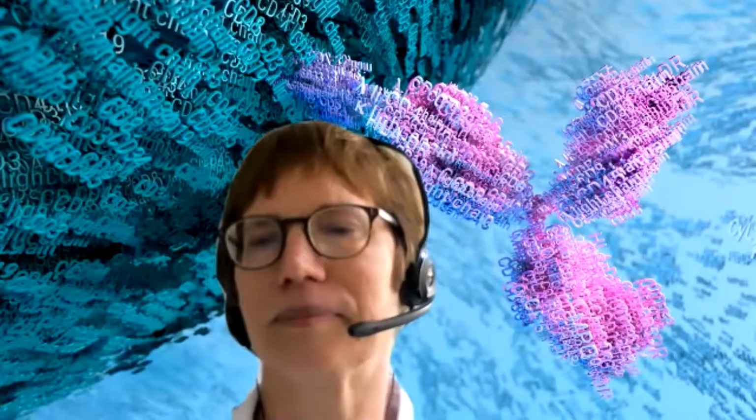Thank you. Are the antibodies in a cool space in the machine? Yes, they are. So there's, as I mentioned, space for 90 antibodies, and they come in these color-coded reagent blocks. They're made of metal, so you can pre-cool them in the fridge, and then they will keep cool for about half an hour, I would say. Inside the system, 2 of the 6 positions for these blocks are cooled to 2 to 8 degrees.